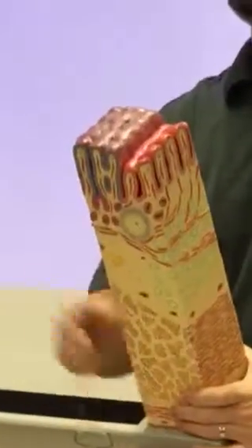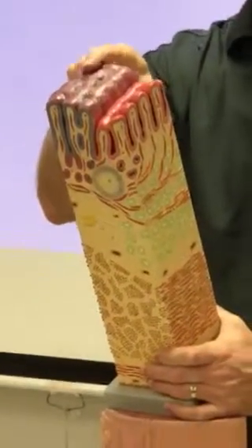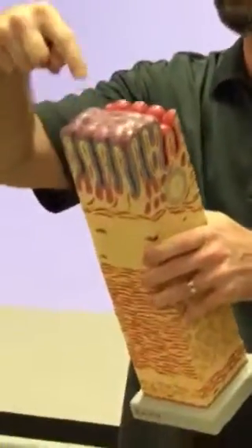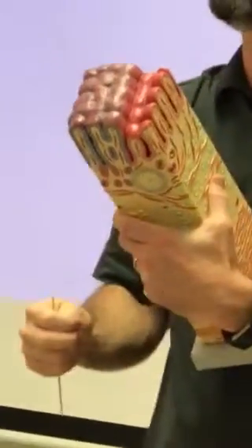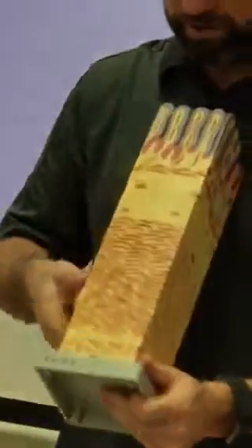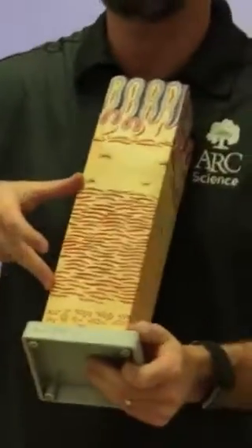So we've got villi again, but then we've also got this flat surface. So I guess potentially it could be transition from small intestine to large, or it could be from stomach to small intestine. So probably the best thing to do is to look at this side, because we already know this is small intestine. We want to know, is this stomach or is it colon? Because from the top, it doesn't look all that different. They're both relatively flat, no villi. So the first thing you should notice here is this huge, thick layer of circular smooth muscle.